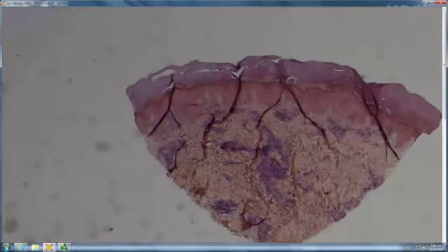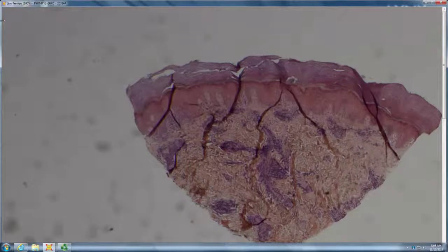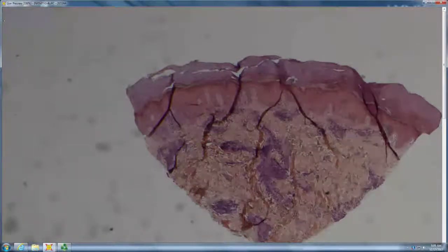Absolutely identical, except it was an adult. It looked like subacute cutaneous lupus. The biopsy looked like tumid lupus, just like this, and it was syphilis. There were other reports at the meeting of mucin in syphilis, so it's becoming increasingly recognized. In fact, there were 2 reports of plaque-like mucinosis, just mucin, as presentation of lupus. Or, I'm sorry, a presentation of syphilis.